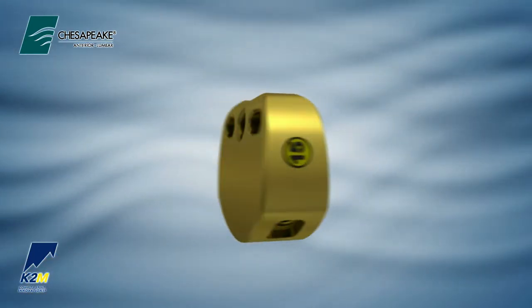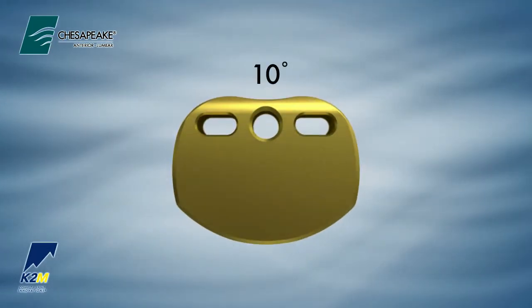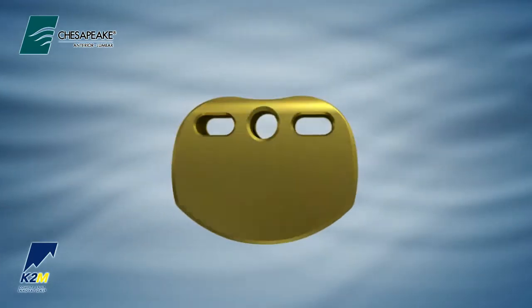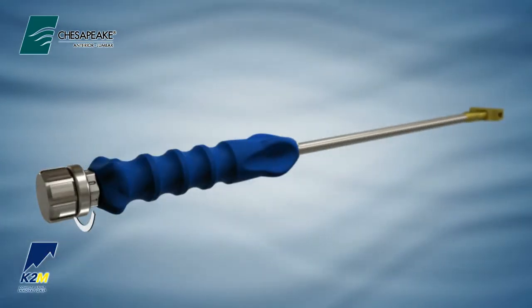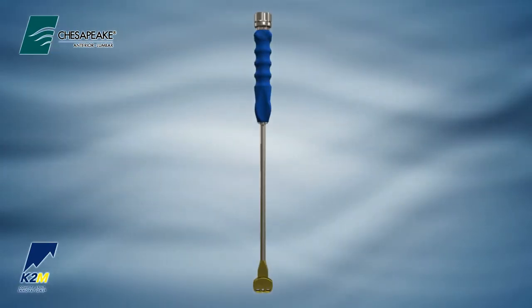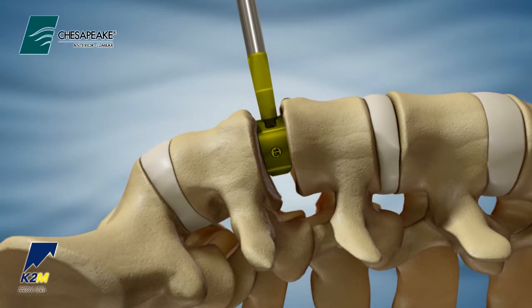Next, to determine the size of the interbody, utilize the trials, which are available in 5 degrees, 10 degrees, and 15 degrees of lordosis. Load the appropriate trial onto the distal end of the trial inserter. Turn the thumb wheel on the proximal end of the trial inserter clockwise to secure. Trials are undersized by 0.5 mm to allow for a slight press fit of the respective implant.